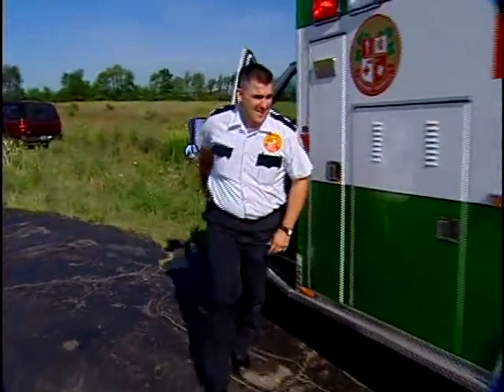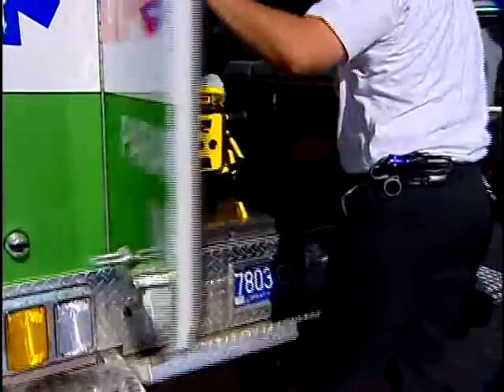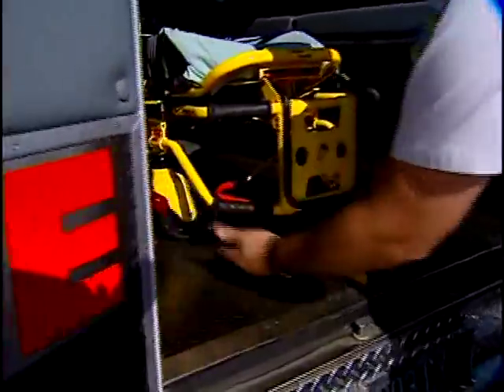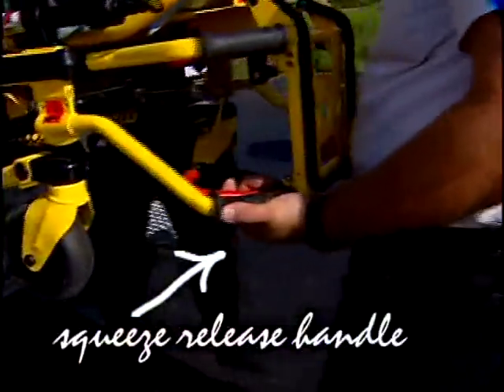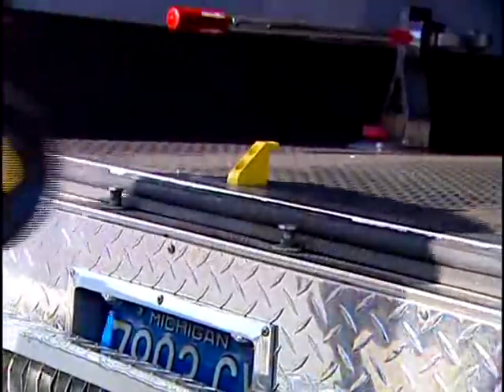When you get to the scene, it's important to be able to unload without a struggle. It's no problem with the MX Pro. Squeeze the height adjustment release handle and guide the legs down. Disengage the safety bar and you're ready to roll.